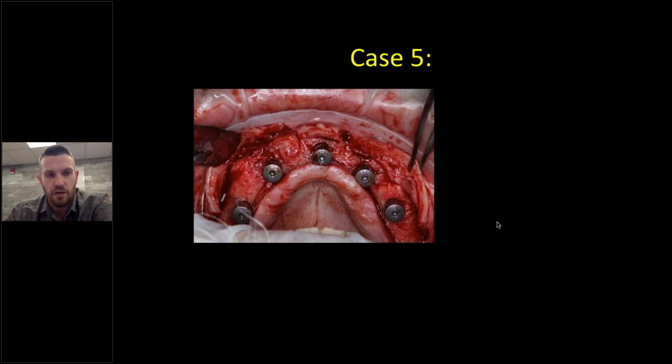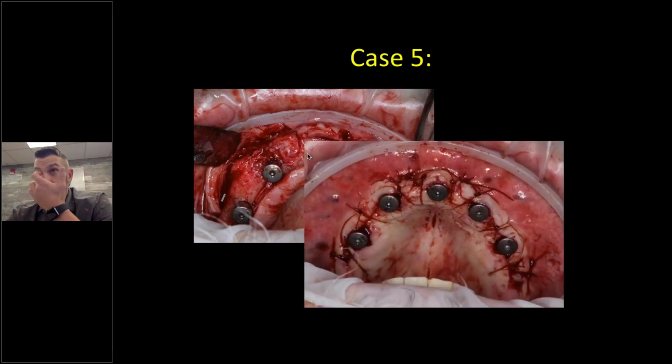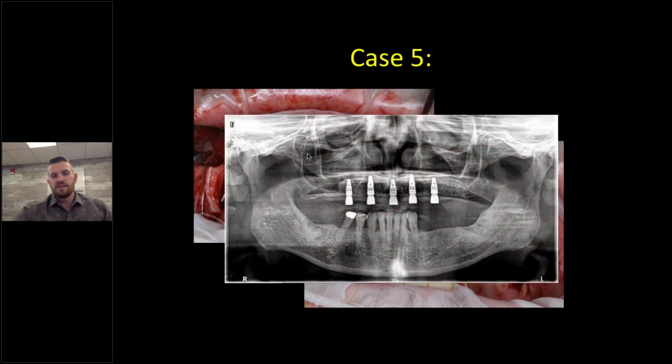This is an occlusal view of those implants, and you can notice that we still see some of the laminar plate up in here, which is always amazing to me. I love seeing that. Some of it has stripped off maybe into the periosteum a little bit, but our regeneration of the defect is amazing. Sutured. And then this is a pano film. You can see that the simultaneous bilateral sinus augmentation was done, and the ridge augmentation at the same time. So truly a remarkable case, showing the good results that were obtained.